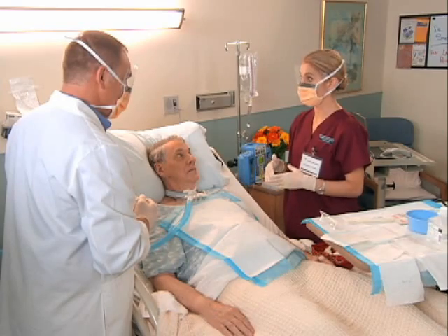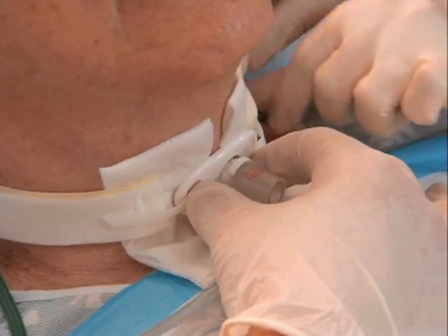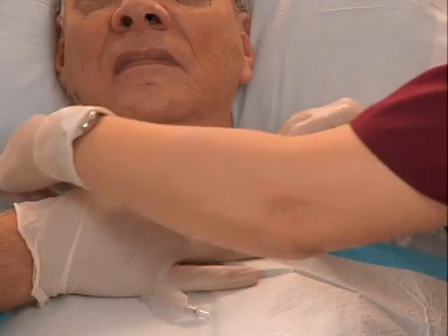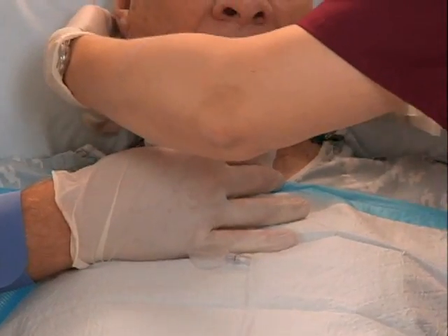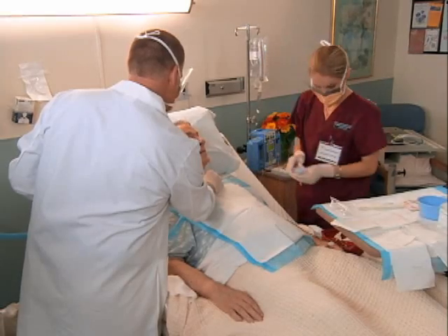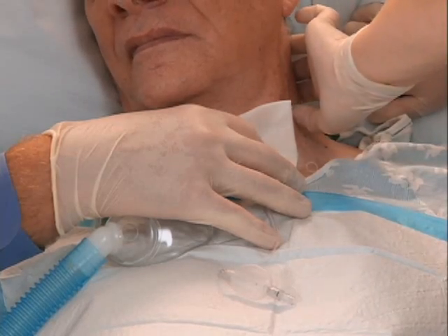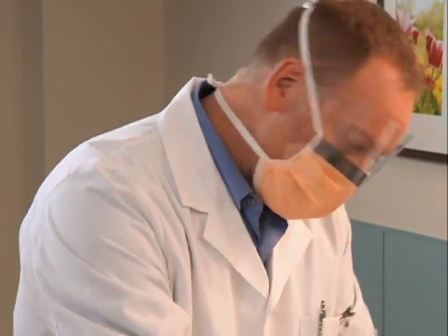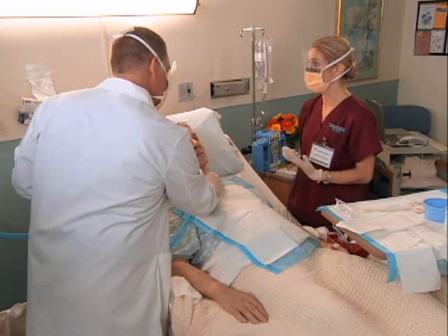You hold the faceplate while I pull up the Velcro tabs and gently remove the collar. Can you turn your head? I don't see any skin breakdown on the posterior portion of the neck. Do you see anything, Mr. McDaniel? Nope. Now that could happen if there were any irritation or pressure from the tracheostomy holder.